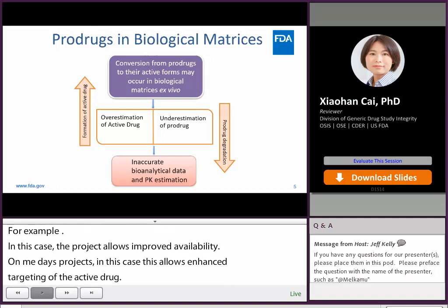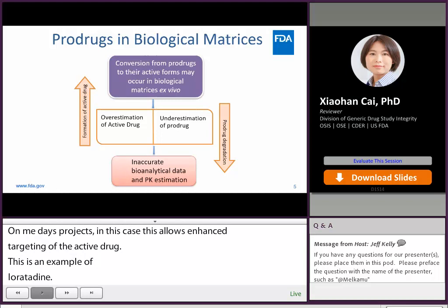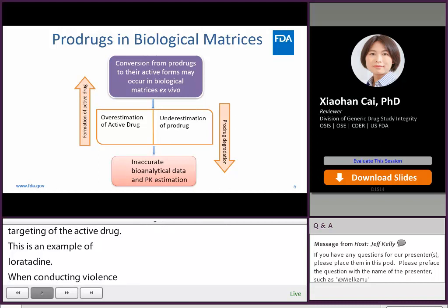When conducting bioanalysis of pro-drugs and their active forms, challenges present because similar in vivo conversion may occur ex vivo. When a pro-drug transforms to the active form ex vivo, this process causes underestimation of the pro-drug and overestimation of the active drug compared to the true concentration present in the biological samples. Ultimately, these processes lead to inaccurate bioanalytical data and PK estimation.